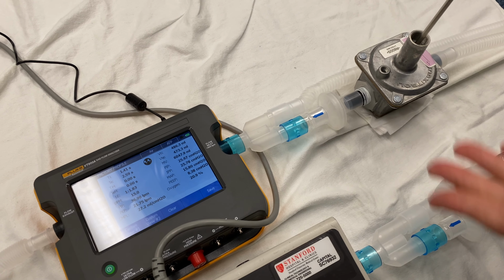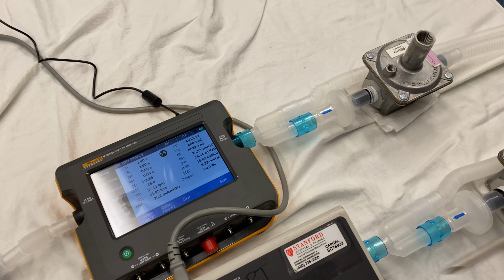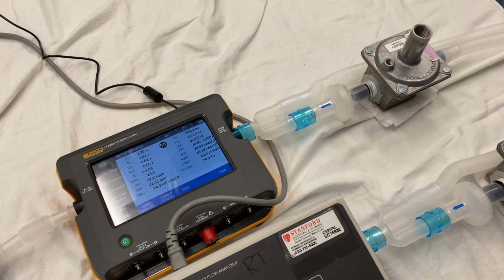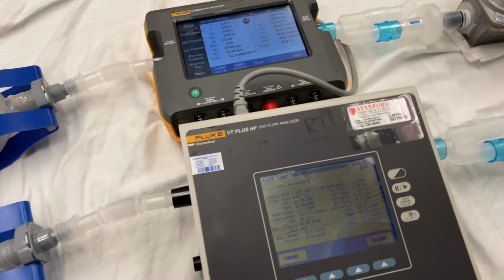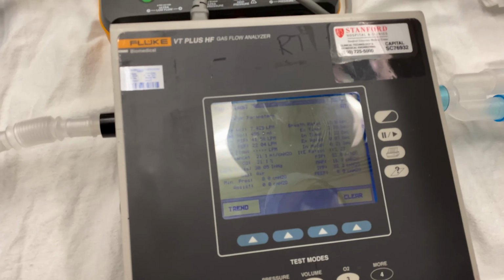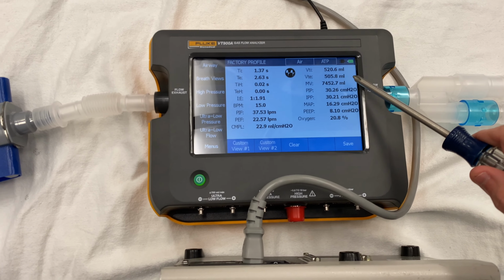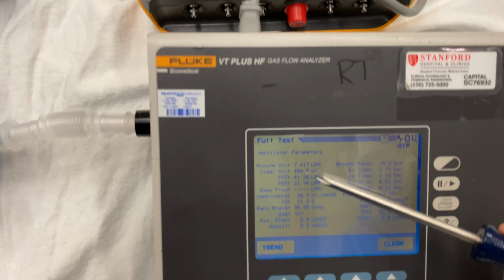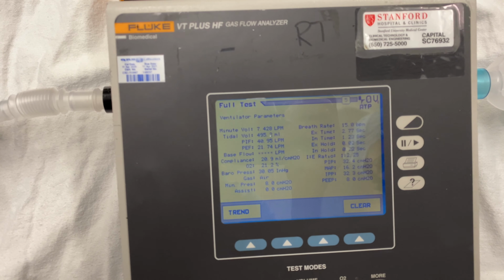And I can reach a point where both these patients are roughly matched, and now getting about the same tidal volume. And on the ventilator, I'm seeing again the summation of the ventilation between these two. But notice that even though this patient has gone from about 100 to now about 500 cc's of tidal volume, this patient's tidal volume barely changed. It's still approximately 500 cc's.